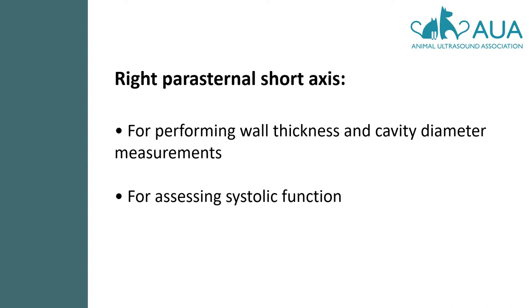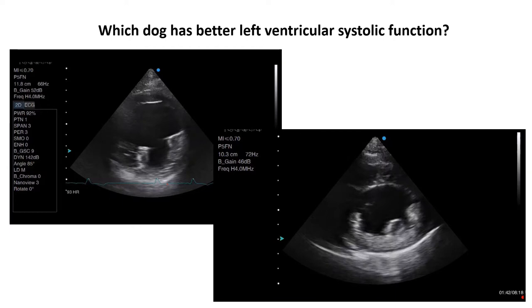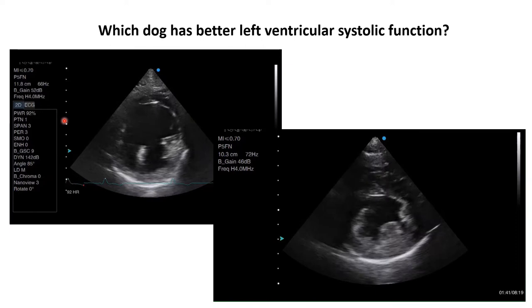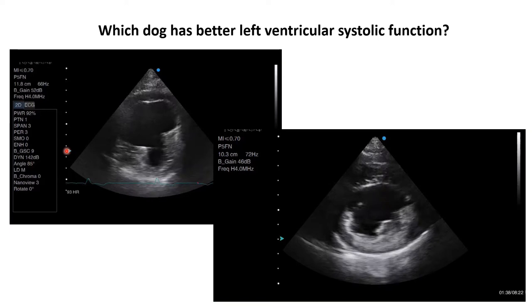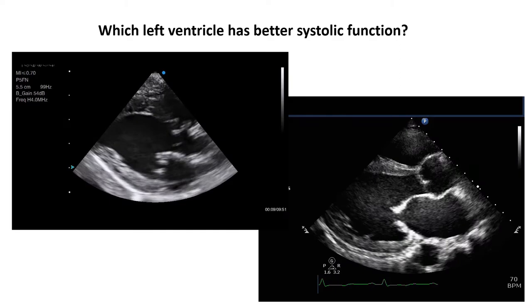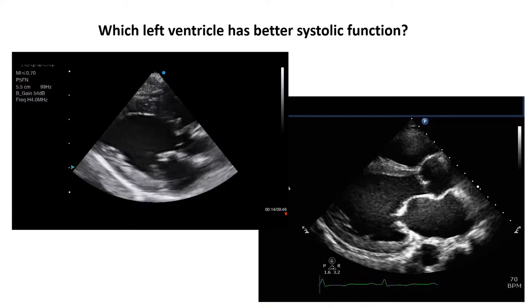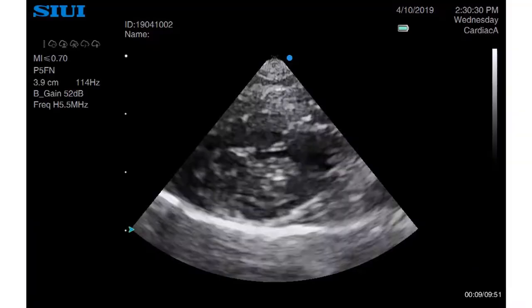The short axis is a great view not only for performing measurements of wall thickness and cavity size, but also for assessing systolic function. Now that you've seen what normal looks like, can you tell which of these dogs has impaired left ventricular systolic function? Can you see, just by glancing at the scale down the side, that the left ventricle for the dog on the left is very dilated? An approximately 8cm diastolic diameter is significantly dilated for any dog. Can you tell which left ventricle is impaired in the long axis view? You don't need to perform an ejection fraction to tell you that.